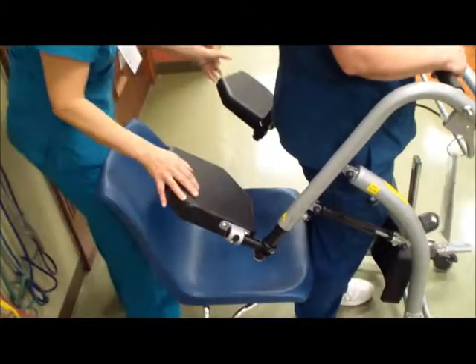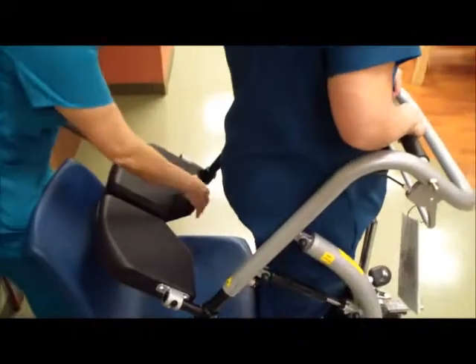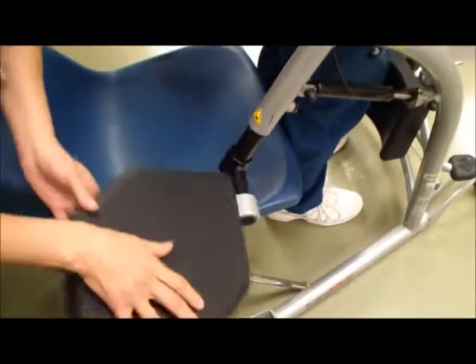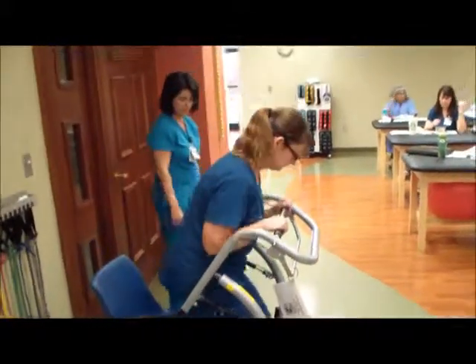I didn't know that at first, so I had a big person and was trying to get these out of the way. I couldn't get them out of the way. It was like, oh, you just lift up and you can wing it out. Push them out of the way first, in case you have somebody large. The brakes are on. Okay, so now you can sit down.